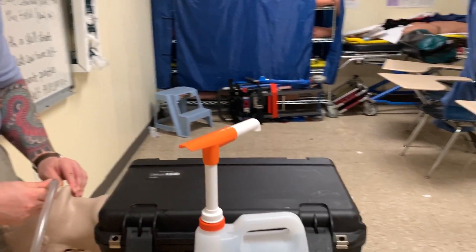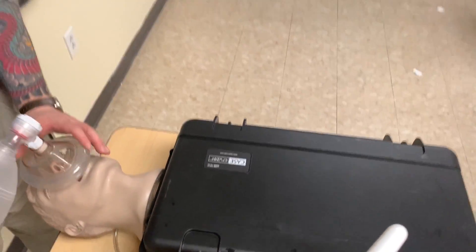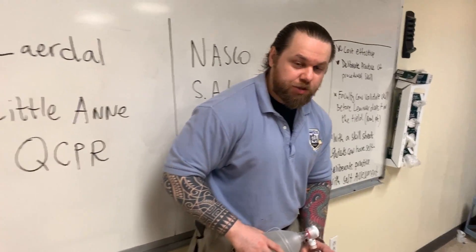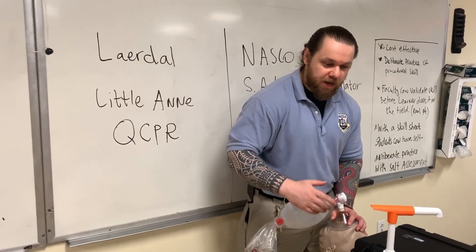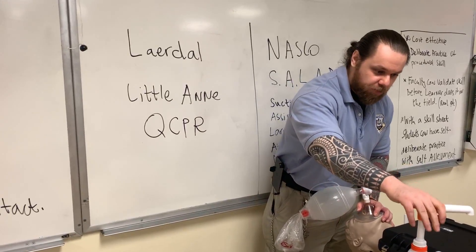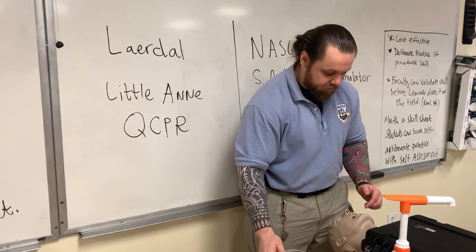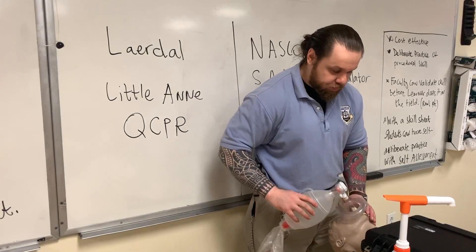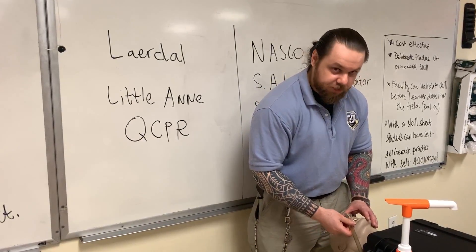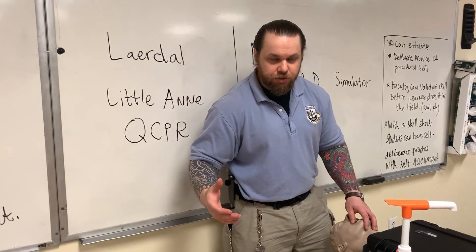Once the airway has been cleared in this dynamic process, you go ahead and ventilate with your BVM. You can train students to alternate between ventilation and suctioning, going back and forth. They ventilate, then you pump and say the airway is contaminated again — blood or vomit in the airway. Students will stop, suction, and return back to ventilating. So these are different test trainers to learn different skills.